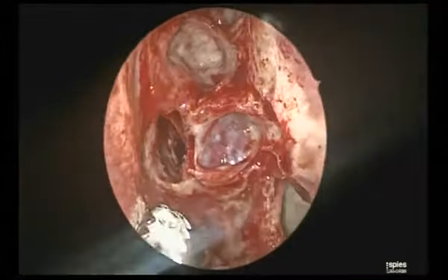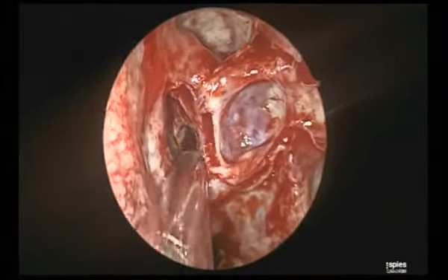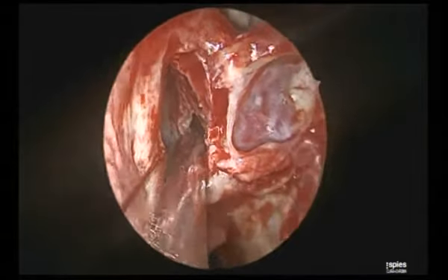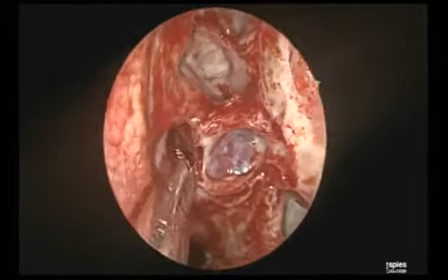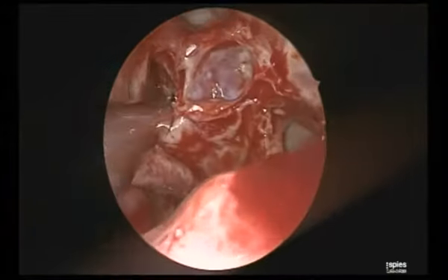So you can very easily, even in the most difficult situation like Onodi or anything, they are always going to be behind the level of the sphenoid ostium. So now in that plane he will go to the lamina. He will remove everything with brush strokes, from medial to lateral, up to the lamina papyracea. So the important thing is again the maxillary line.